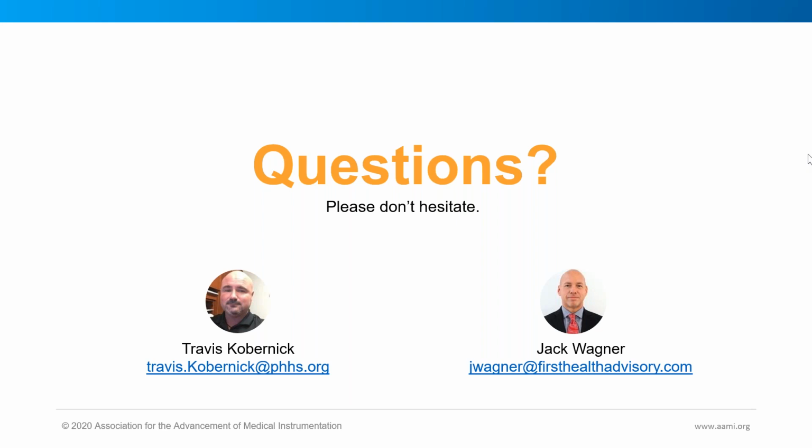So I'll take part of it and let Jack chime in as well. The legacy devices, like older systems that are connected to the network, are probably violating all sorts of information security rules. We have a number of those, to be honest. And the beauty of these tools is that if we cannot install patches, there are no software upgrades, it's on an out-of-support Microsoft OS so we can no longer do any updates, the tool will monitor that device's behavior, and if it does any sort of suspicious, potentially malicious behavior, like talking to an inappropriate IP address somewhere in the Netherlands or wherever in the world, it'll throw up a flag.